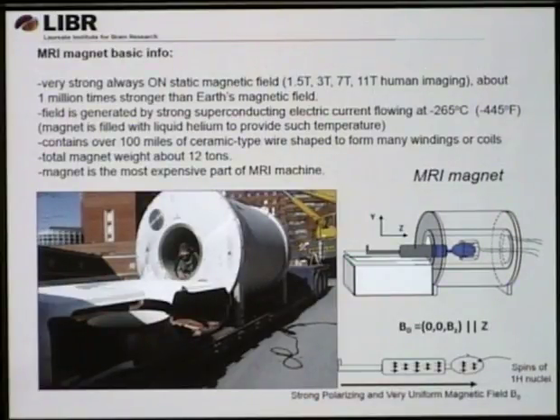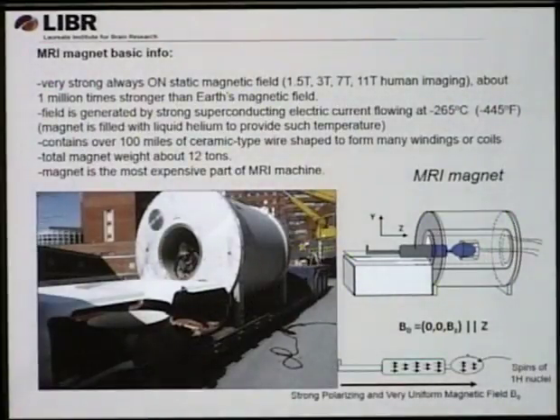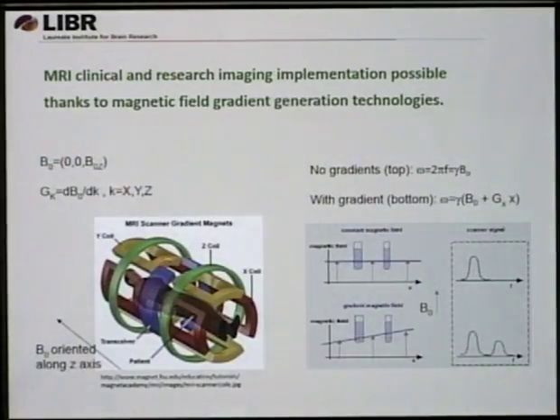And then at this low temperature inside the magnet, the current can flow constantly without interruption and produce a strong magnetic field. And that's what is actually used to produce the measured signal for imaging. And by the way, this picture was actually taken at NIH in 2004, when my first 3 Tesla whole body system was decommissioned after 6 years of successful operation.